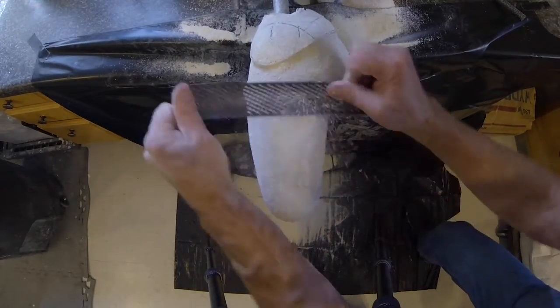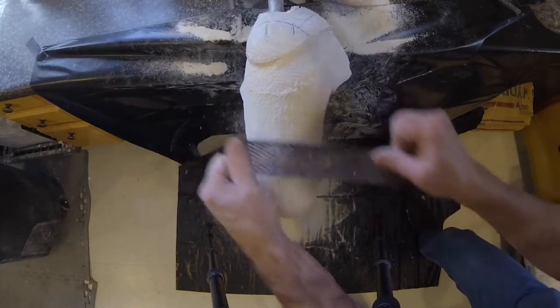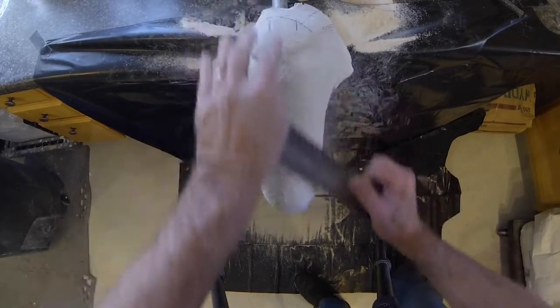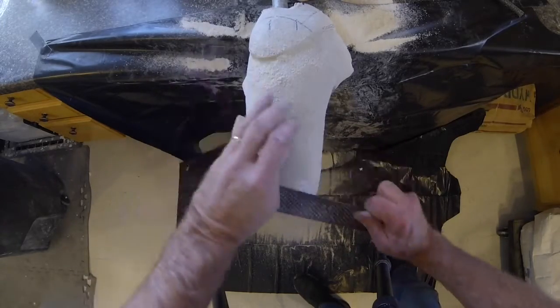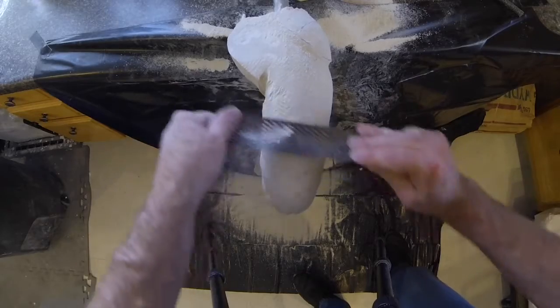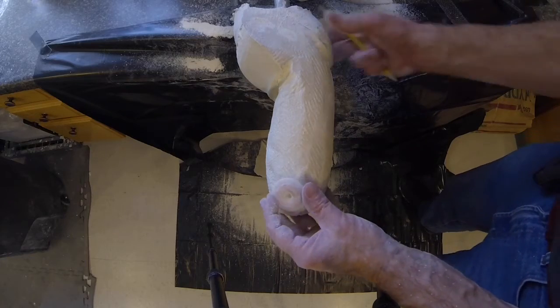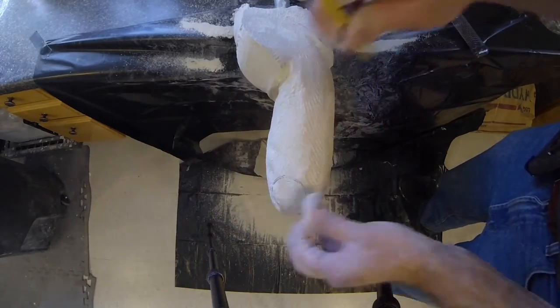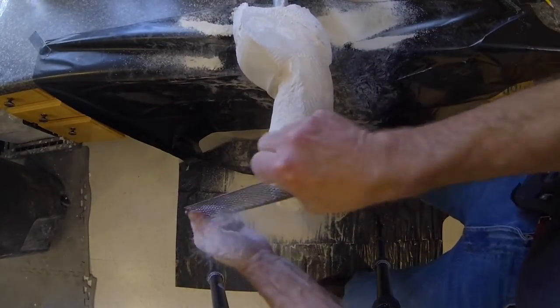Blend the lateral wall into the trim line modification as shown. If a valve will be used to facilitate donning by use of a donning sleeve, the area of the valve must be flattened as shown. The valve is placed anterior and medial, as far distal as possible, but still allowing easy access.